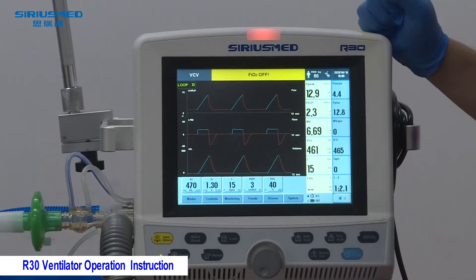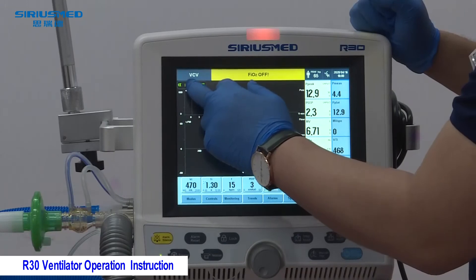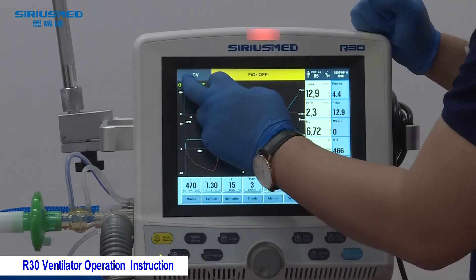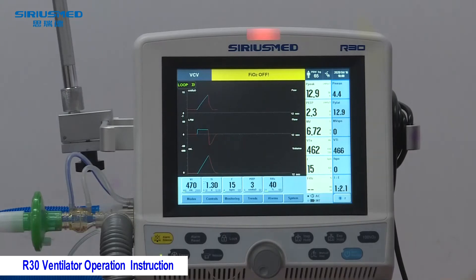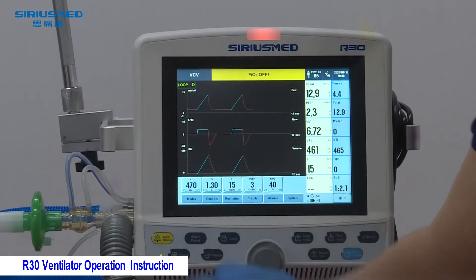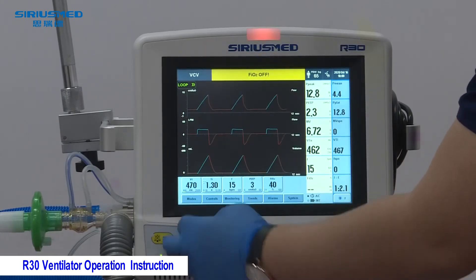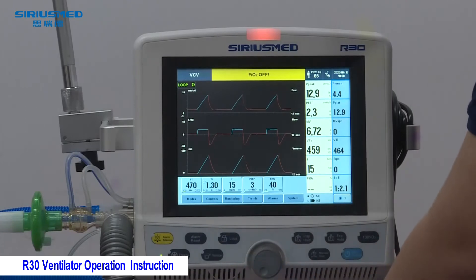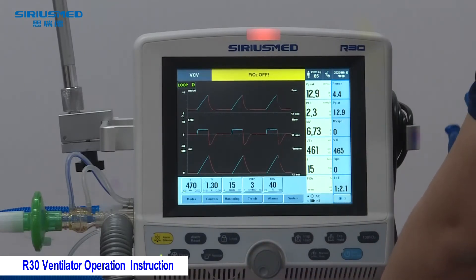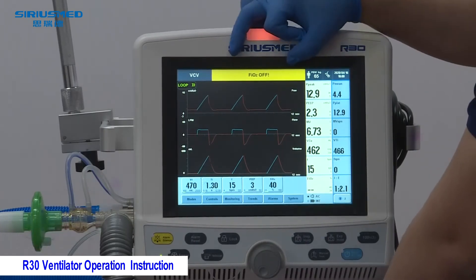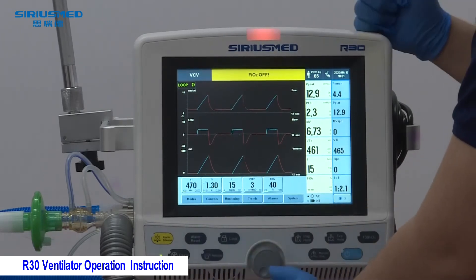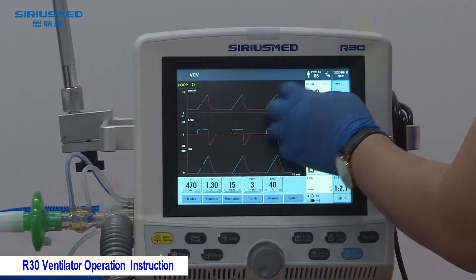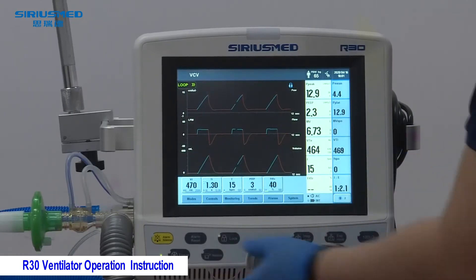In the Date section, you can view and change the date and time. To view the patient loop, touch the loop display button to see it, and touch again to return. Regarding the bottom buttons: the first is Alarm Silence, which silences alarms for two minutes. Alarm Reset clears previous alarms that are still displayed after the alarm event. The Lock button locks the screen so no changes can be made — a lock icon appears, and touch it again to unlock.